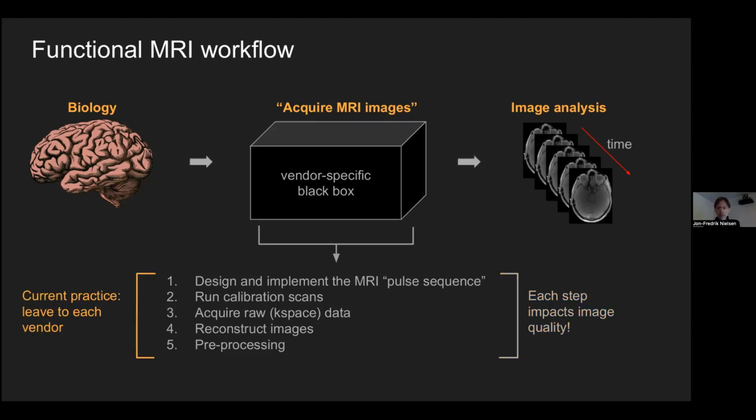And at the moment, for the most part, we leave this to each vendor. Just to acknowledge that, of course, the vendors have provided incredible hardware. And on each vendor, the tools are really push button and easy to use. They produce images that are useful. The vendors probably don't have a large incentive to harmonize across different vendors. And so that's where we come in.